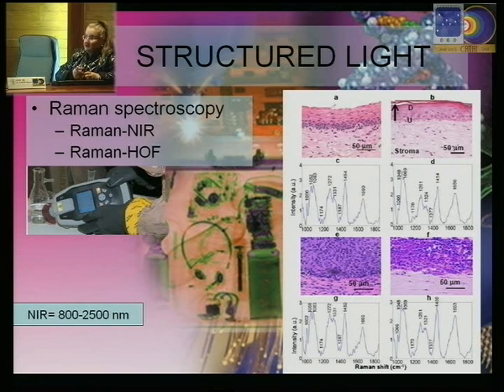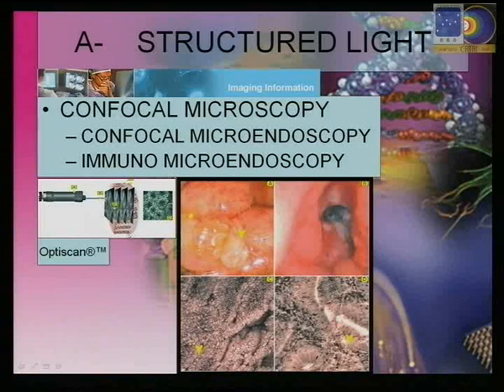And this is what has been mentioned previously, that probably in order to select, in a screening of the slide, areas which are suspicious, it will be better to think of spectroscopy than of artificial intelligence in order to identify the type of cells according to the pathology criteria.